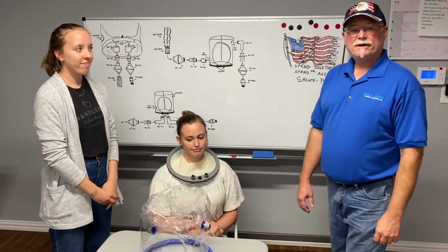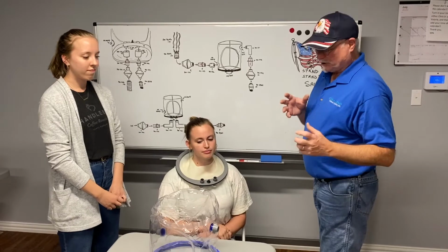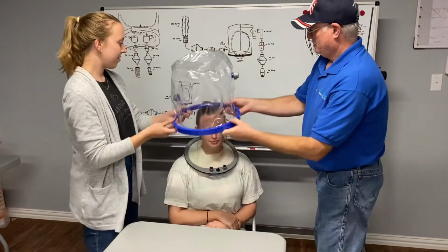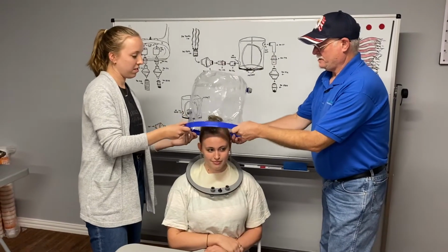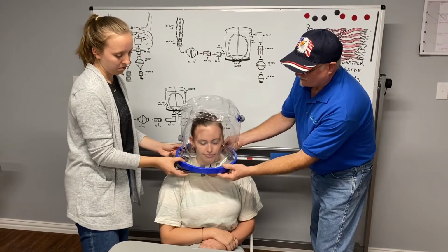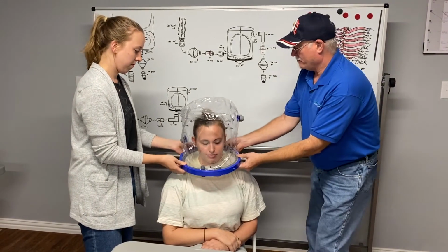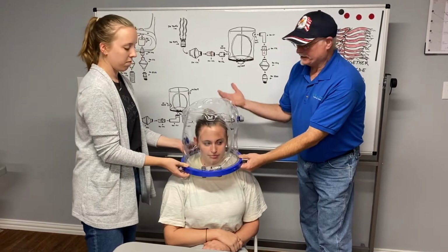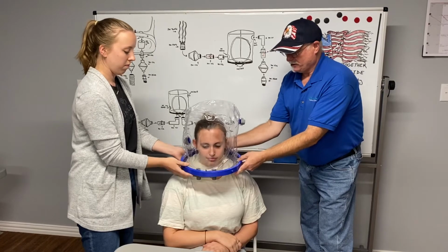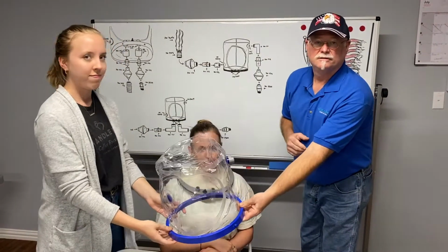All right, now we're ready to put the head tent on the patient. With our wonderful assistant, in this case she has hair we have to contend with. We'll put it over the front. We'll start right here, always with the front, then we'll move around and push it in. That easy. To remove it, you start at the back, pull it apart, and then come off in the exact reverse.